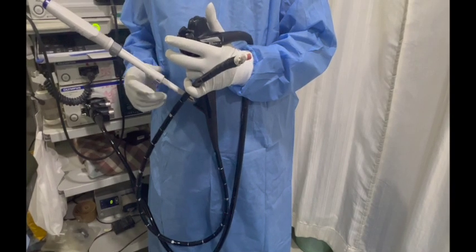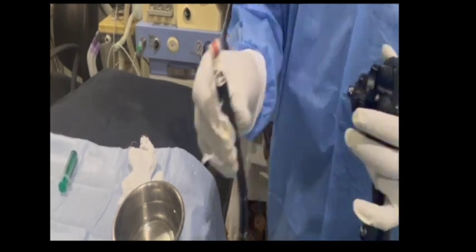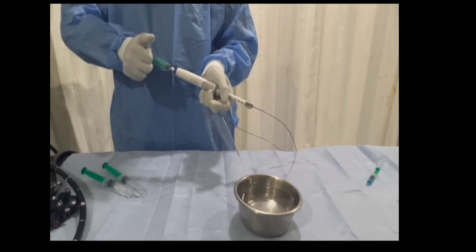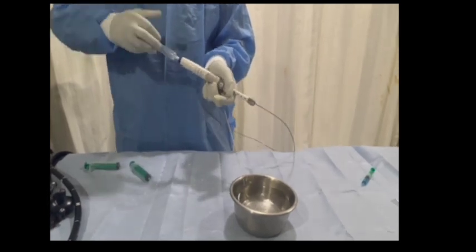Remove the FNA needle from the scope. Clean the scope transducer with water or acetone. Flush the working channel with 30 to 40 ml of distilled water followed by a burst of air to clear off any glue debris. Perform a similar maneuver for the FNA needle.